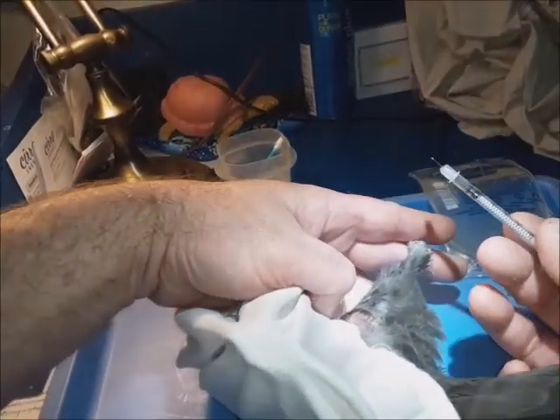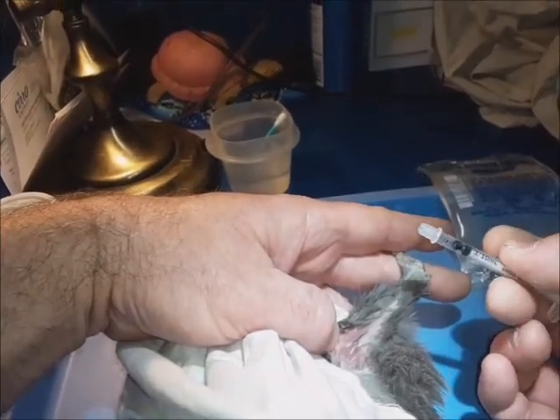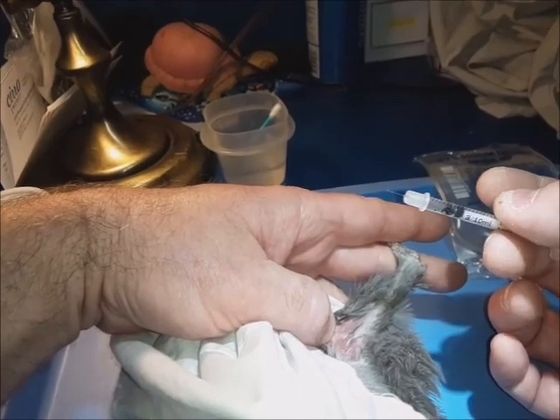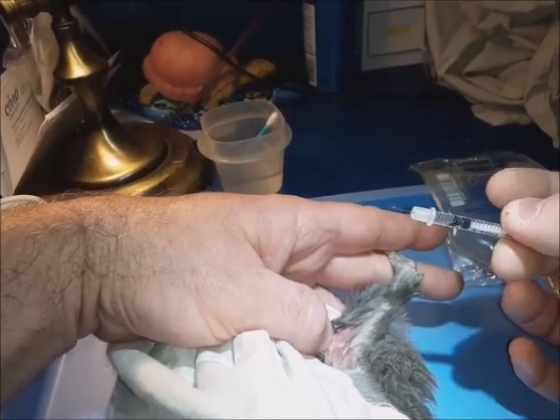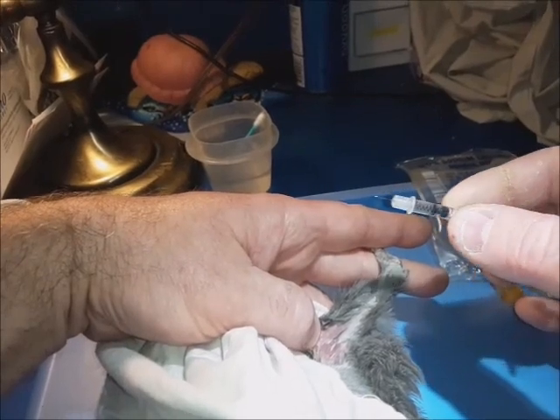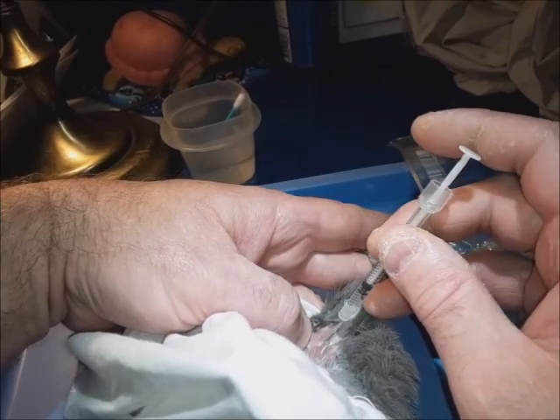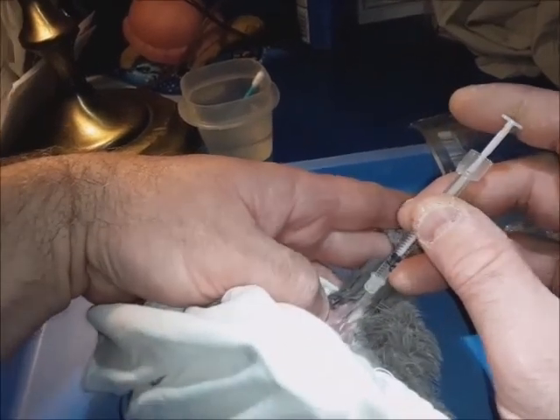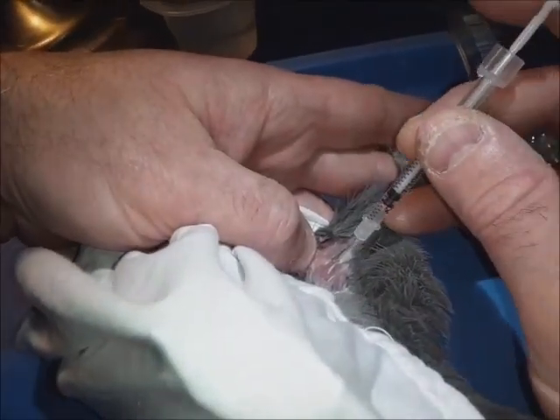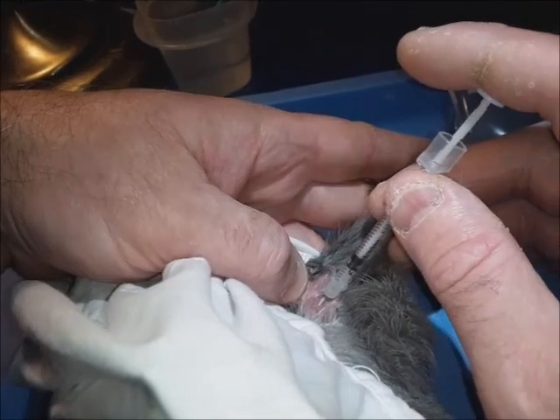I'm giving about five units. Turn the needle so you can see the bevel — the cut edge of the needle. You want the beveled edge to be up. Then direct the needle in at about a 45-degree angle to the leg to make sure it goes deep enough.